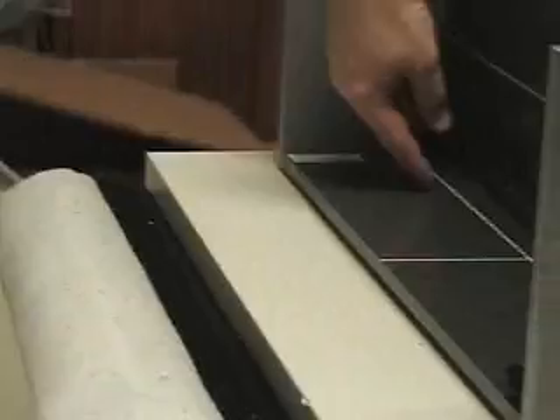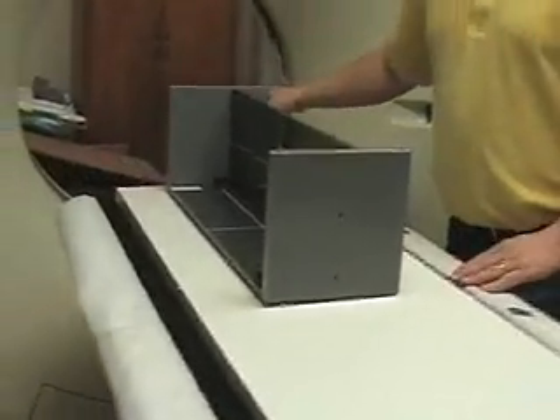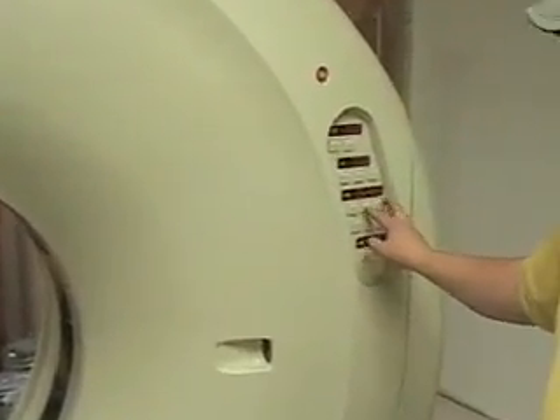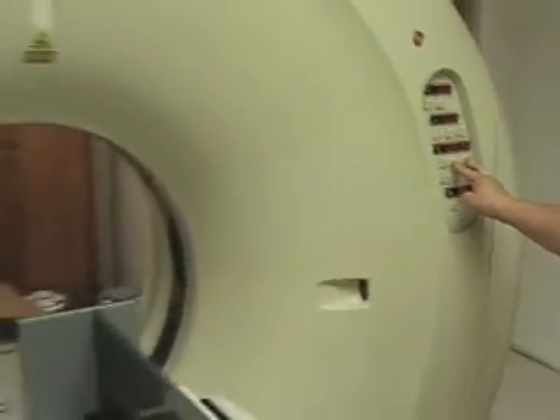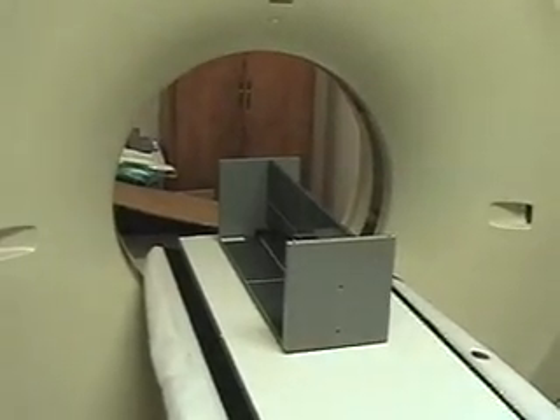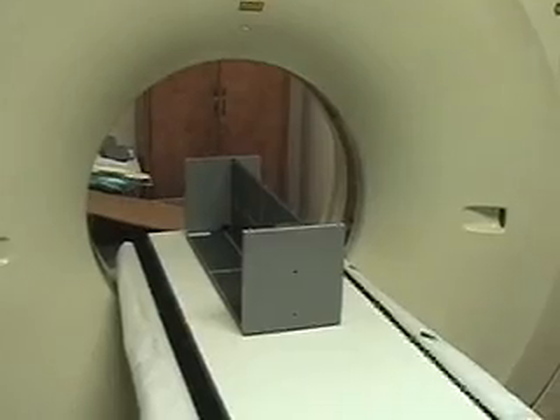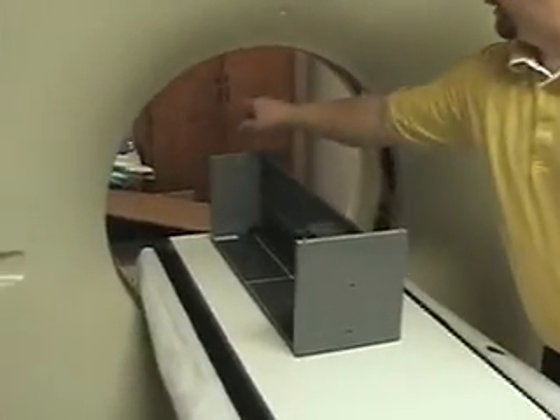Sometimes there's a bubble level in the phantom. This is just a rough start — we just need to place it on the table, and then we're going to drive it into the CT with the CT controller. We're just going to drive it in until it's close to the CT lights.